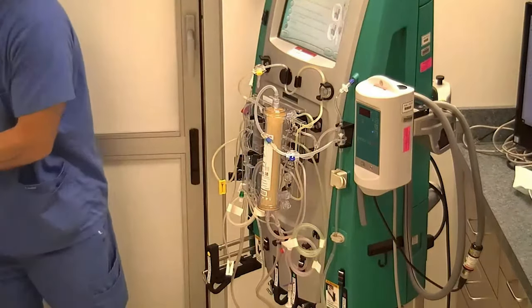Once the machine is done priming, it will automatically kick in to the test mode. From here, once it's waiting, it's testing for the scales. Typically, you have about 7 to 8 minutes for this first priming. And then from here, if you need to, you can go do any more of your RN interventions that you might need to do for your patient or another patient that you have.